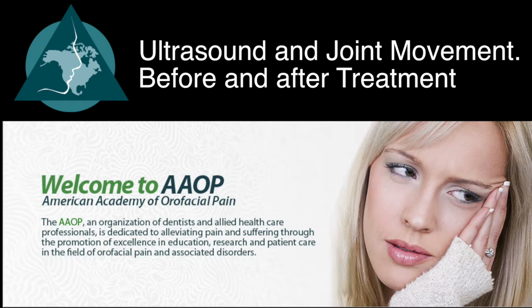Yeah, and so from that standpoint, it's a really good learning tool, and for the patient too. You can even show the patient. So you could use it educationally, like I do often, for things like translation. You can show them how the bump, that lateral condyle, is moving all the way across the screen on one side, and on the other side it barely even moves.